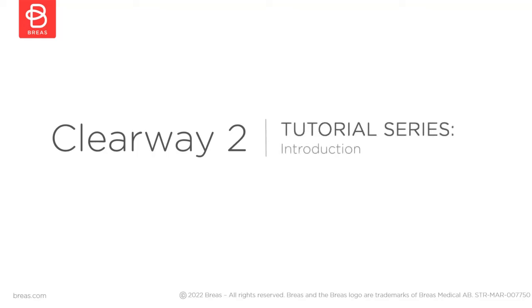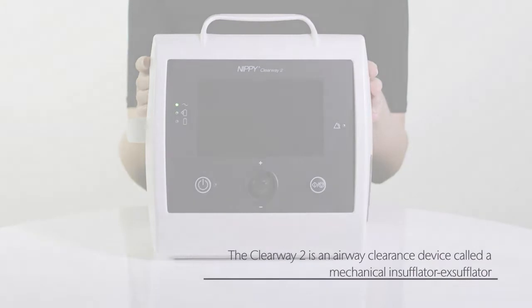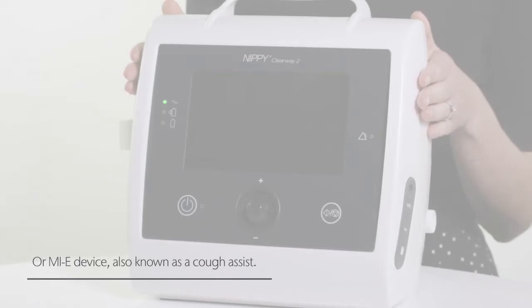Hello and welcome to the Breas tutorial series. In this video I will provide a short introduction to the Clearway 2. The Clearway 2 is an airway clearance device called a mechanical insufflator exsufflator or MIE device, also known as a cough assist.